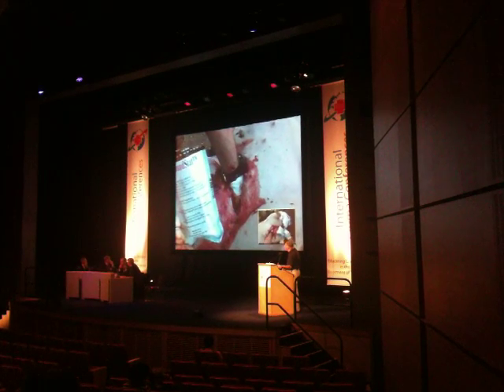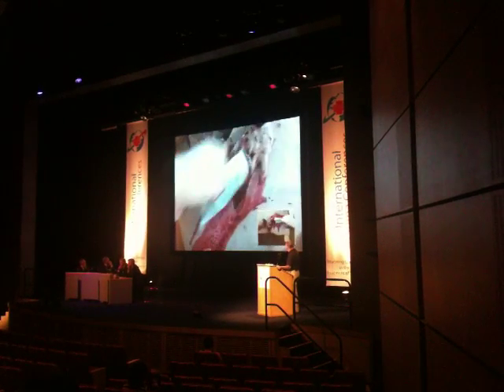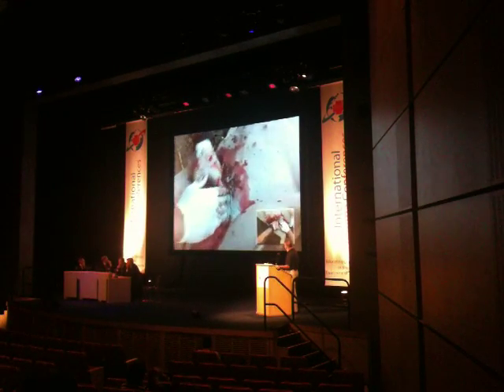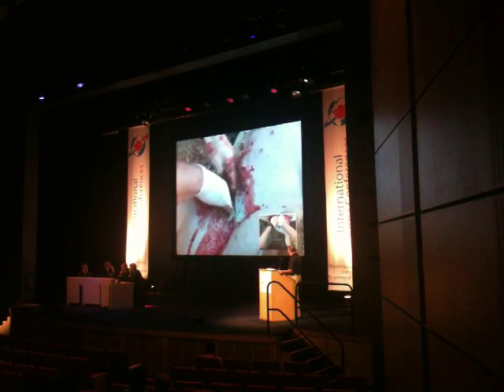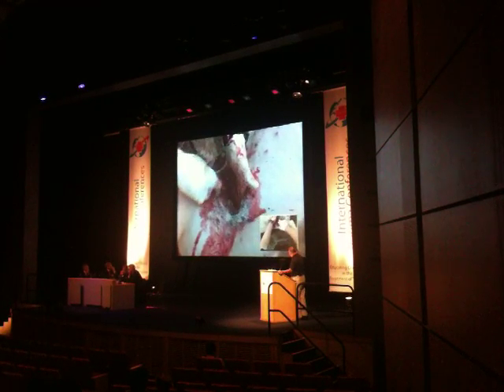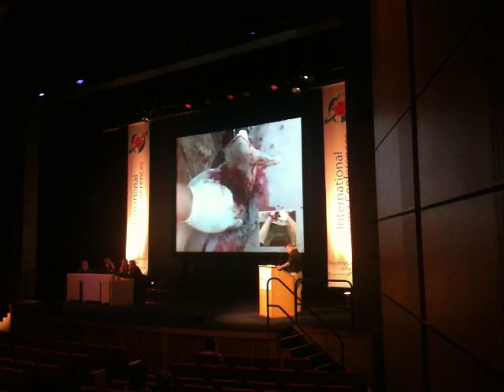Here we have the forbidden fruit: the wound stat. The instructor immediately begins kneading the product, forcing the wound stat down to the bottom of the wound bowl where it can occlude the high-pressure bleed. The consistency of the wound stat when mixed with blood is approximately that of plumber's putty.